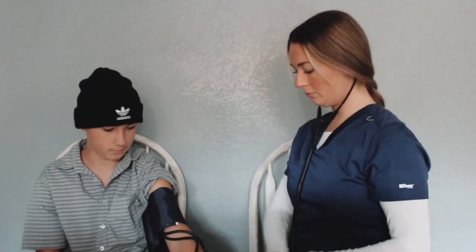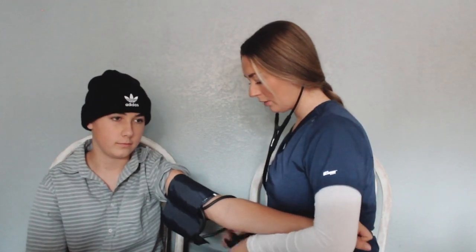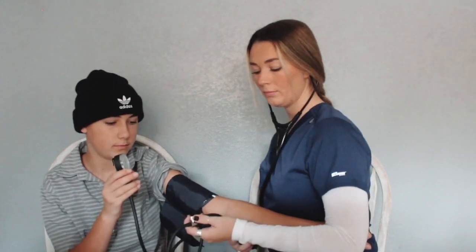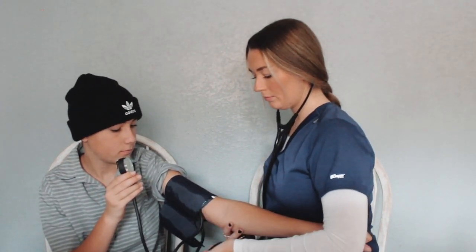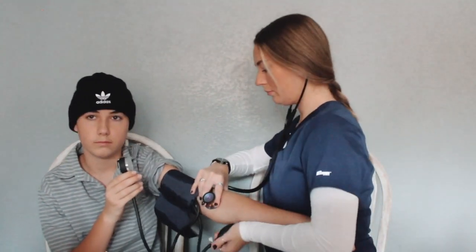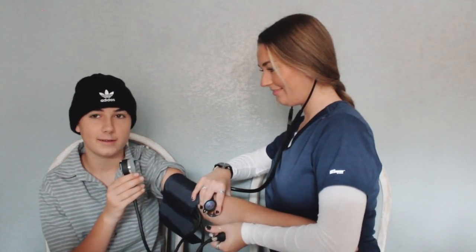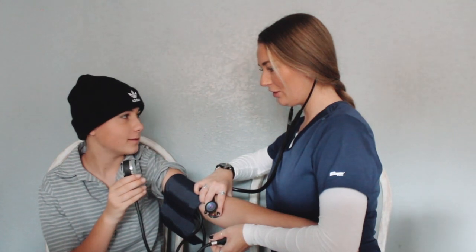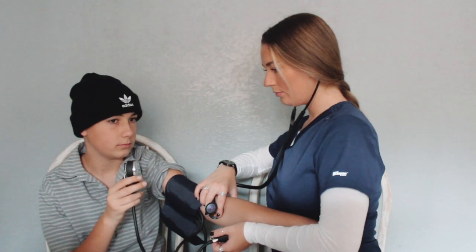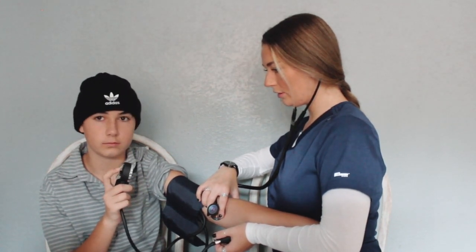Next, we will grab our stethoscope and place our ear tips in our ear, and grab the chest piece of the stethoscope and place it over the strongest brachial pulse point we found with the pad of our fingers. Now, we will take our blood pressure cuff, specifically the bulb and valve, and make sure that the valve is closed. We will then begin squeezing the bulb. We will stop squeezing when our gauge reaches around 180 mmHg. Now, we will begin to slowly release the valve, actively listening closely for the first beat we hear, which will be our systolic number, and listening closely again for the last beat we hear, which will be our diastolic number. Once we hear the last beat, we will fully release the valve and take the blood pressure cuff off our patient.